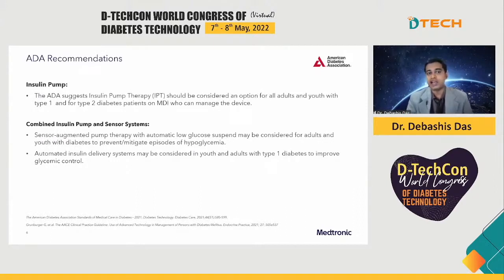ADA recommends that insulin pump therapy should be considered an option for all adults and youth with type 1 and type 2 on MDI who can manage the device. That's the plain insulin pump. On sensor systems, sensor augmented pump therapy with automatic low glucose suspend may be considered for adults and youth with diabetes to prevent or mitigate episodes of hypoglycemia. And AIDs, that is automatic insulin delivery systems, could be considered in youth and adults with type 1 to improve glycemic control. So this is the stand which ADA takes.